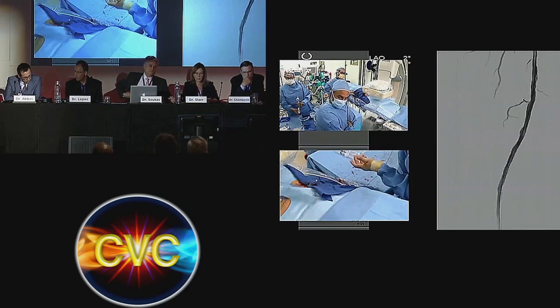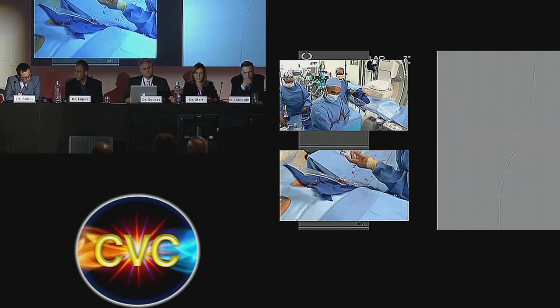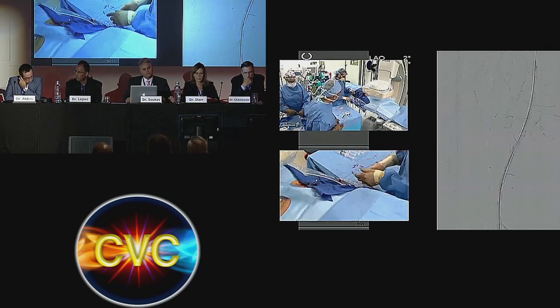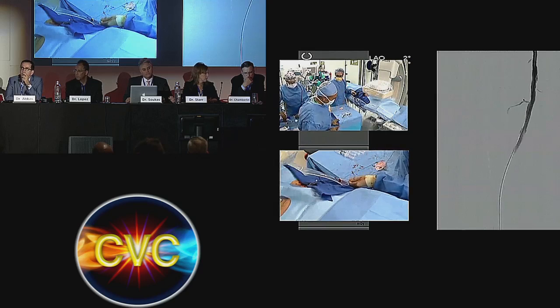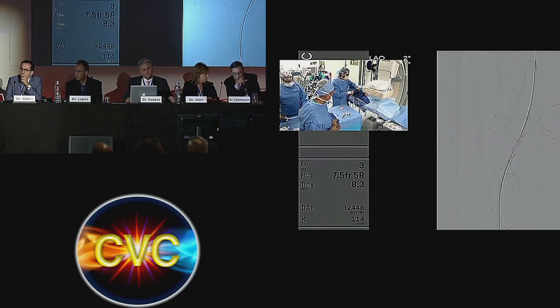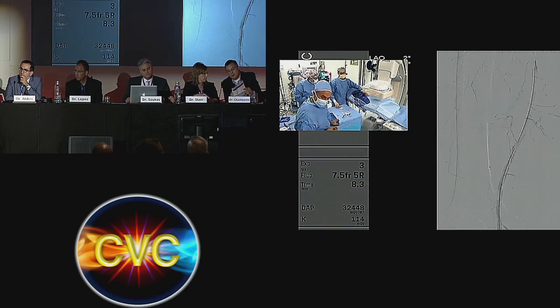So I would not have any trouble if in this gentleman I had to do a popliteal stent, knowing that we already have freedom from TLR at 3 years. Data from Supera is quite amazing, with fairly good patency rates in 7.8 centimeter lesions in the SUPERB trial at 12 months. So 12 and 24.